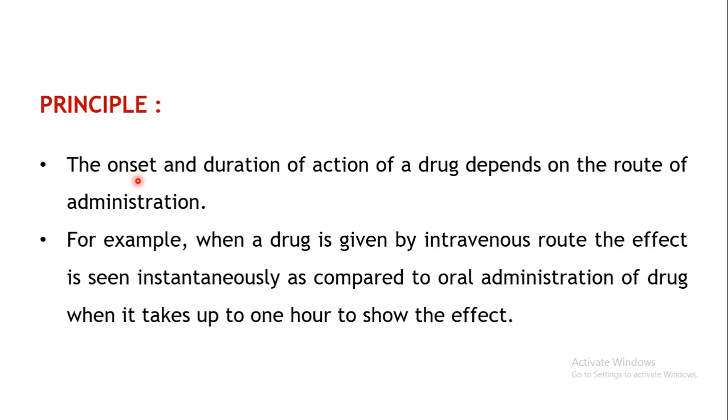If you administer the drug by parenteral route, obviously it will show quick action. We have seen the properties under the routes of administration, right? So onset will depend upon the route of administration.